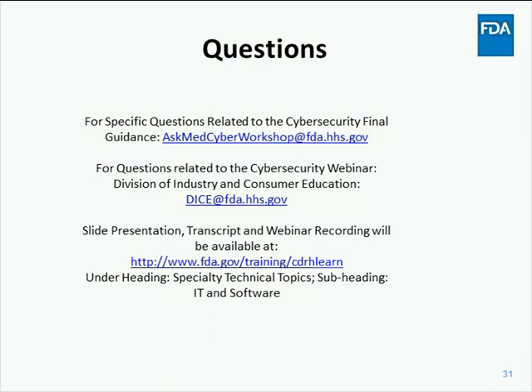No, as it applies to manufacturing software, it does not apply. I would venture to say that the outcome of an exploit in manufacturing software would result in what? A manufacturing defect, like a physical defect in the product? So no, we didn't. That is out of scope.